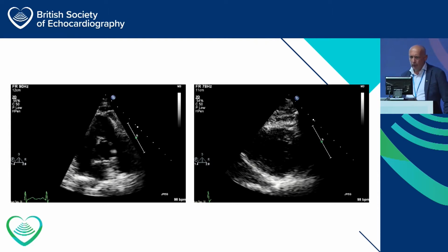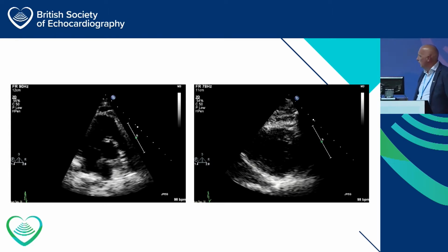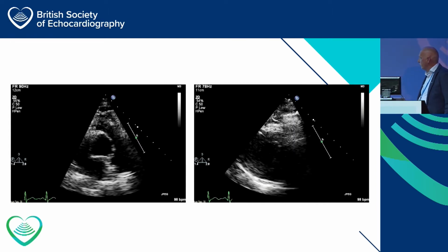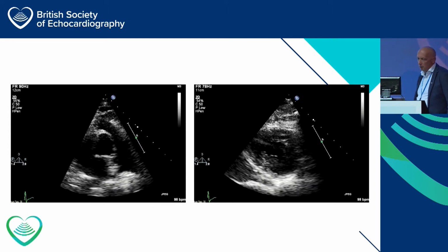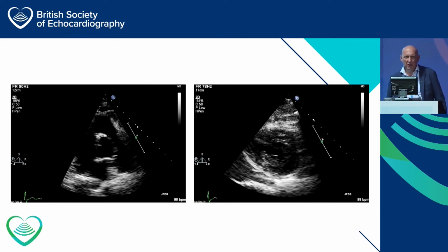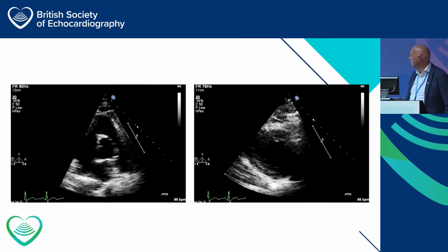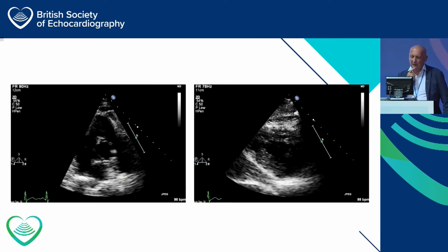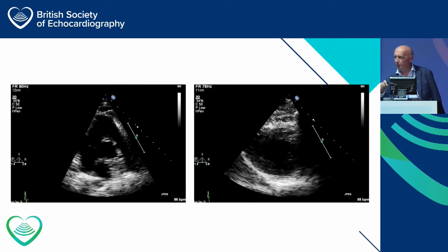So we go around to the parasternal views. You get a little bit of a short axis at the aortic valve level and a bit at the mid-cavity level. And again, nothing major, but there is a linear little structure just there. And I'm thinking, there's got to be a better view of this. So you go off-piste a bit, don't you?